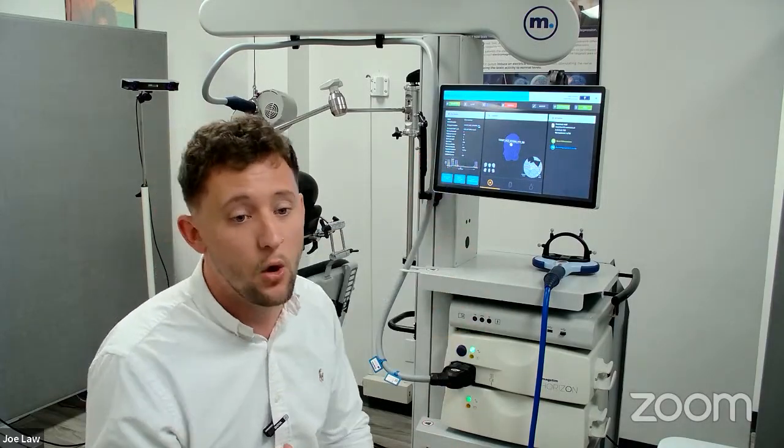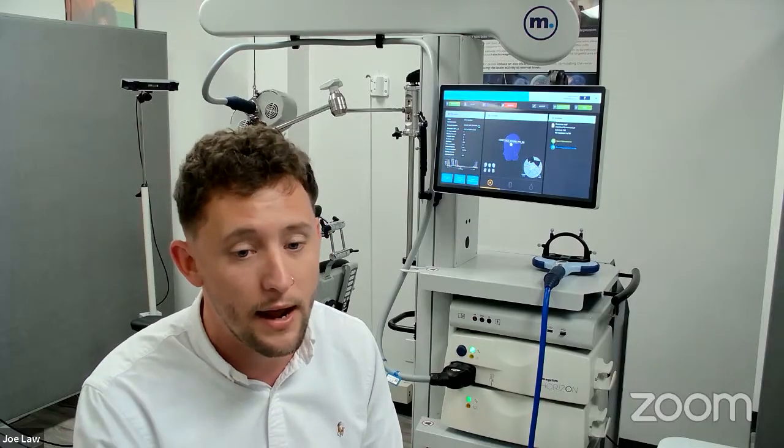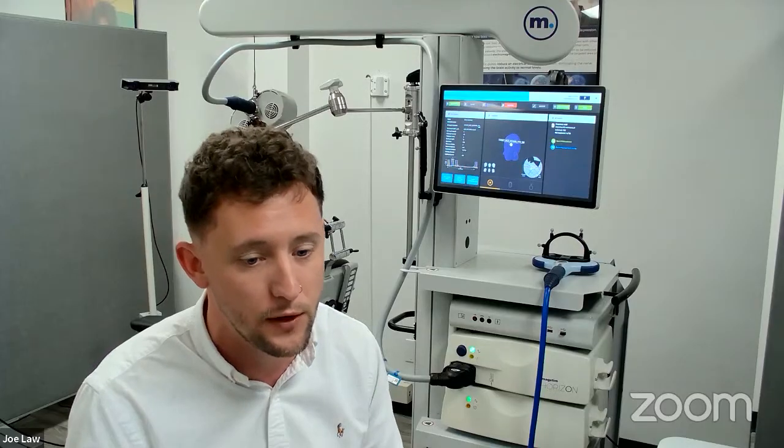So you'll be able to see all patients' treatment, all traceability, how they've gone. Again, with the analytical system as well, you can see if there's any correlation between things. So you have full access. You don't have to be in the clinic to use this. You can do it fully remote. So I hope that answers the question.